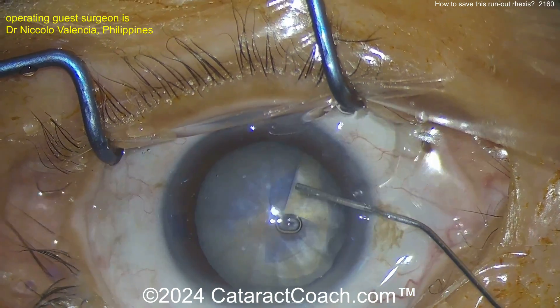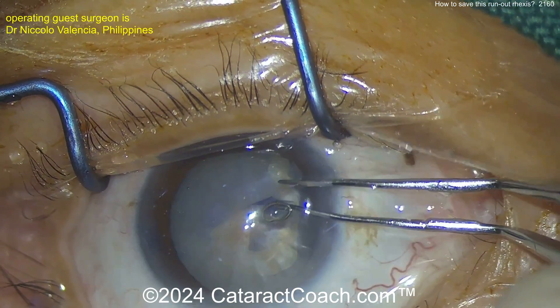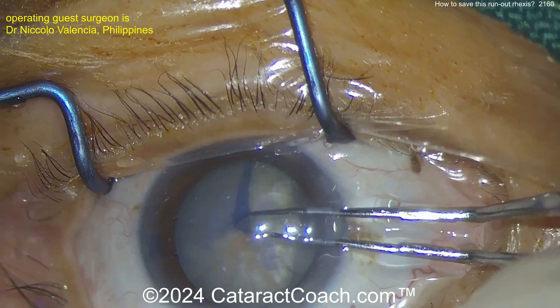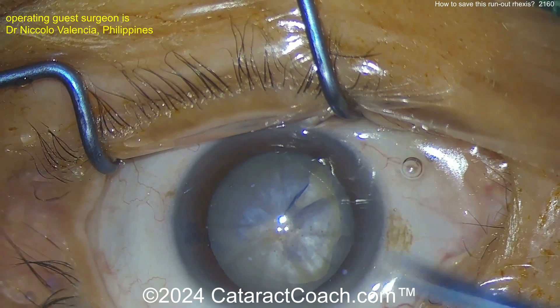Now it's all the way out to the zonular support, so it's trapped in the zonular fibers. It's really going to be difficult to pull it back. You can try the Brian Little maneuver here — that may or may not work — grabbing it and pulling back. But continuing as you want to is not going to happen.